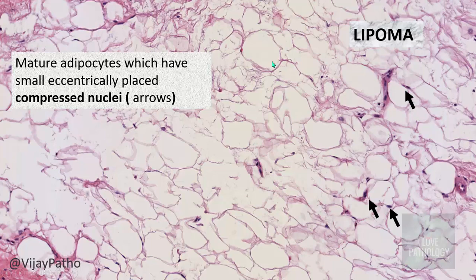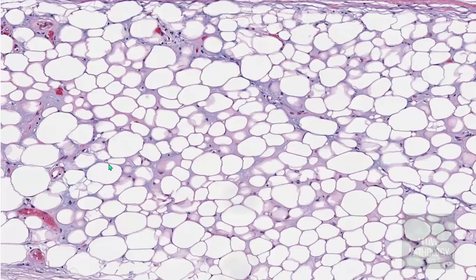These sections are from a particular plane, so when the section passes through the plane where nuclei are present, you can identify them. Otherwise, all you see is just a membrane-bound empty space. Lipomas are composed of mature adipocytes, and when nuclei are present they are eccentrically placed, short, small, and compressed. In between, you can find delicate fibrovascular septa. You have to demonstrate the presence of a thin capsule.